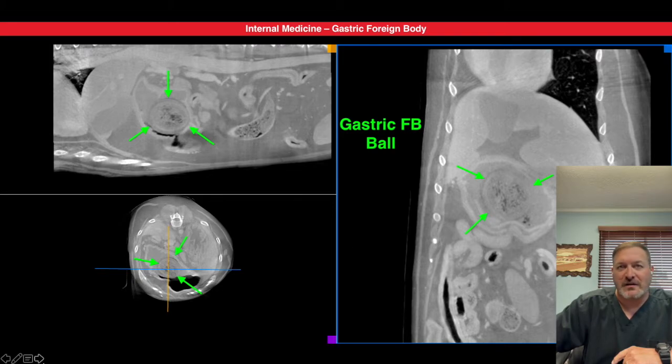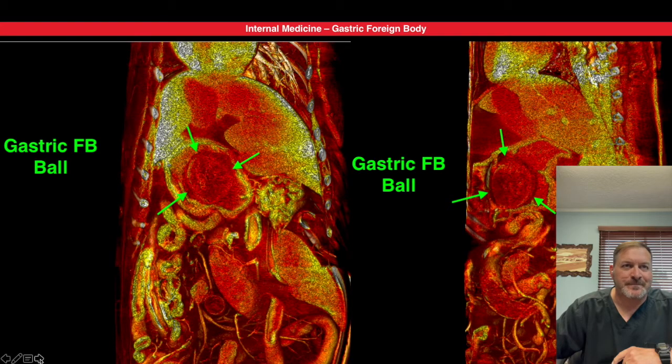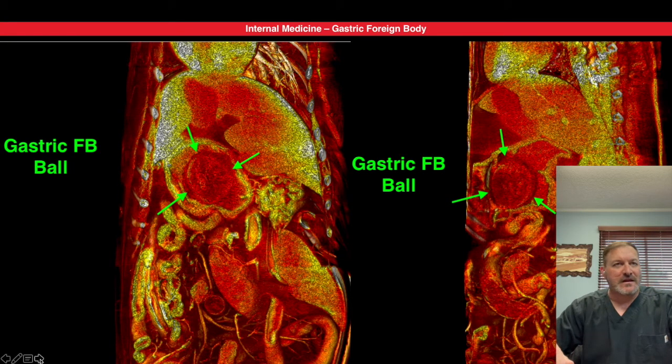So very interesting, because this dog was not showing symptoms. This was an asymptomatic, non-clinical German Shepherd coming in for a wellness visit. And here we have it in 3D color, where we're seeing it from the coronal view on the left side of your screen, and on the right side of your screen, you're seeing it from a lateral or sagittal view. So it's clearly a circular, spherical GI foreign body that we would have never known about had A, we not been doing wellness exams in this specific practice, and B, taking radiographs as a part of that.